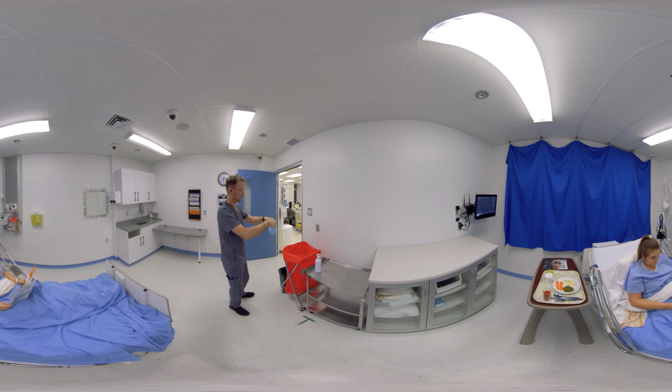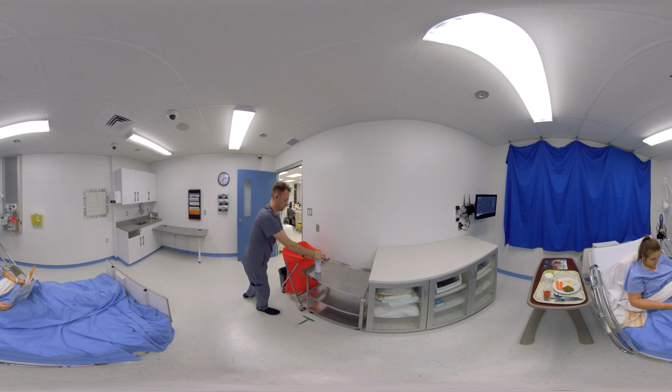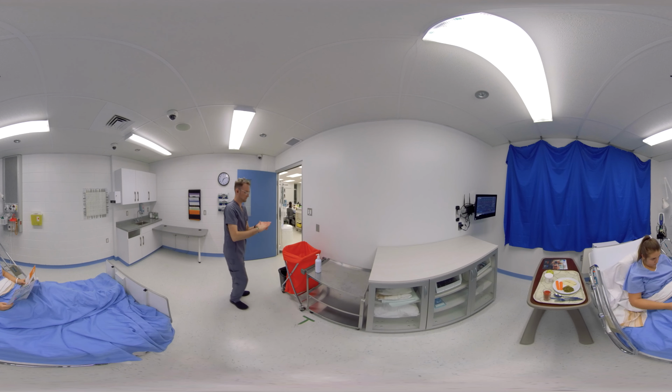The nurse grasps both elastic loops behind his ears and removes the mask by pulling it away from his face. After, he shall proceed to hand washing one last time with an alcohol-based solution. In the case of an isolation due to more contagious and resistant bacteria, for example, Clostridium difficile, it is mandatory to proceed to hand washing with soap and water at the end of the procedure to mechanically eliminate the pathogenic agents.